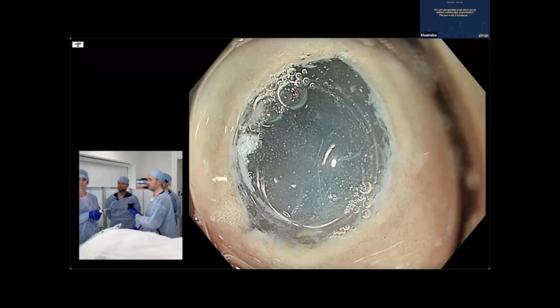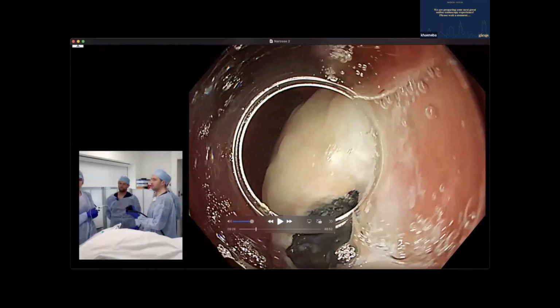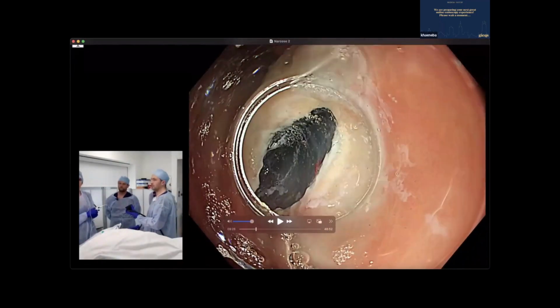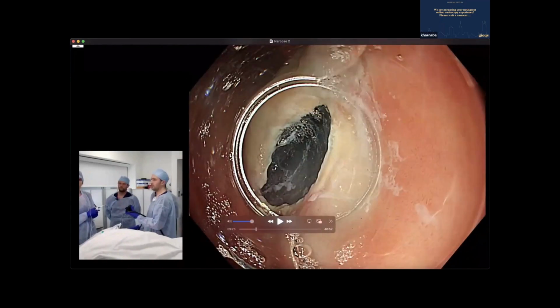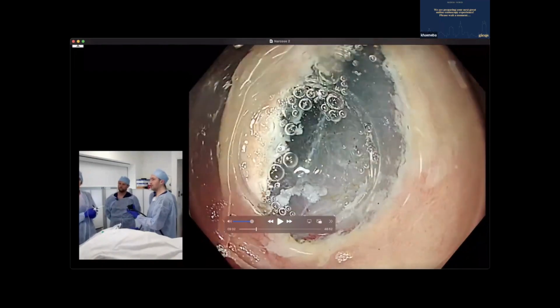But it is: make an incision, trim, trim, trim underneath to get the endoscope in. Use a conical cap. This will get you in. Then look, see this movement? I want to see where I'm going. Get the directionality right. It still wasn't very easy, was it? Let's be honest, as much as I tried.